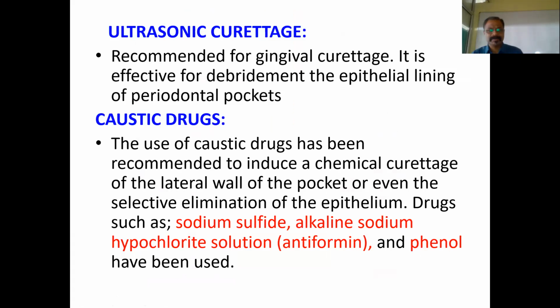Along with that, you can also do curettage procedures by using ultrasonic scalers. This is recommended, and it is very easy. Instead of using a curette, or if you intend to do hand instrumentation, you use ultrasonic scalers for supra and subgingival professional mechanical plaque removal.